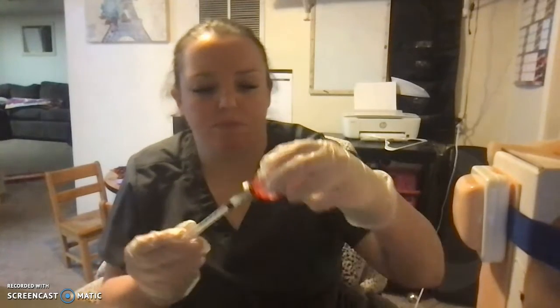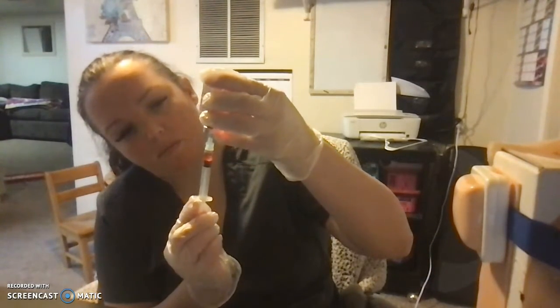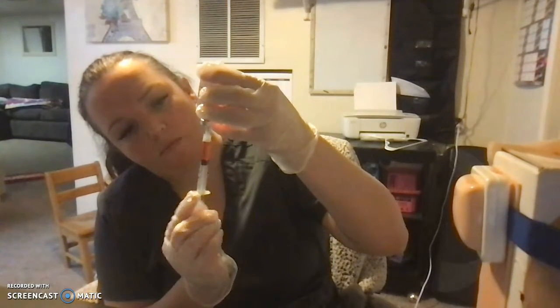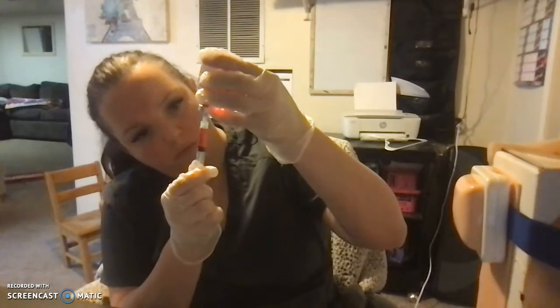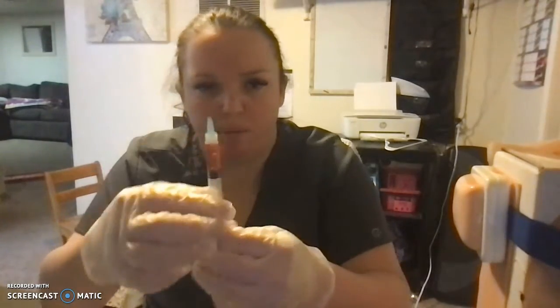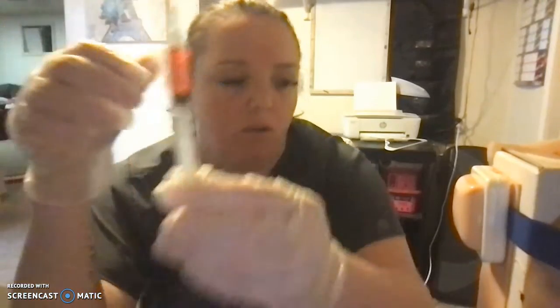Push the air into there. Ensure that there's no air bubbles. And again, that would be 1.5 mLs, and that is equal to 6 milligrams of morphine.